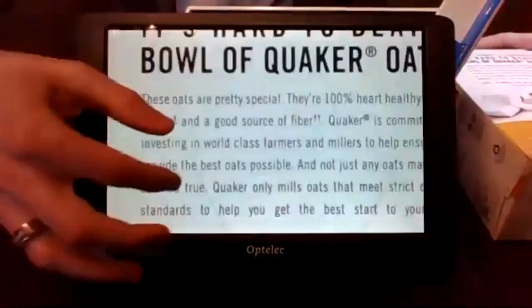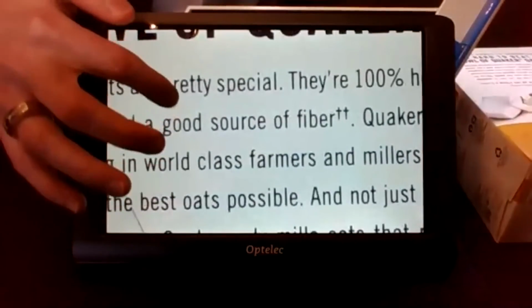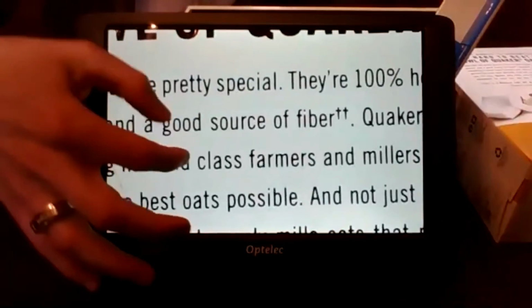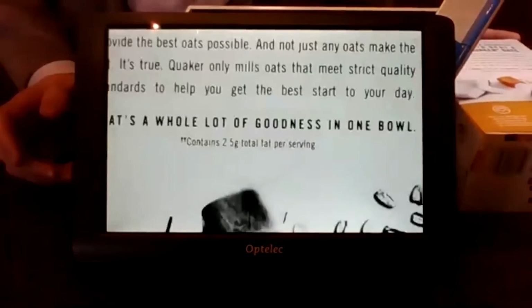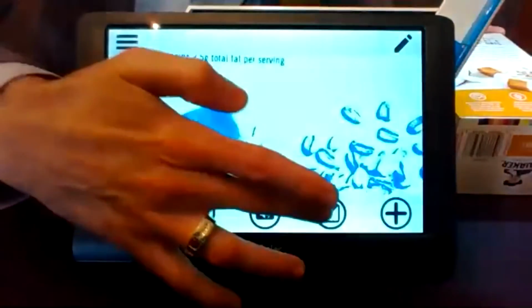So now I can just fit this under there because you've got plenty of space, and zoom in, and I can then change my contrast to read that. I can zoom in, zoom out, snapshot that, and if I want to move that around, I can go back to my live color as well.